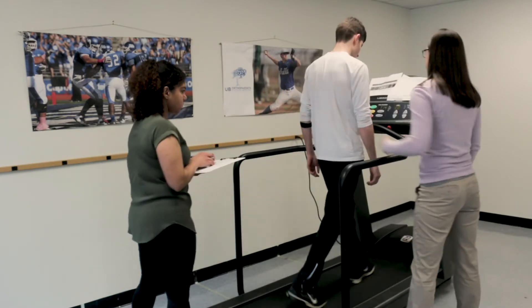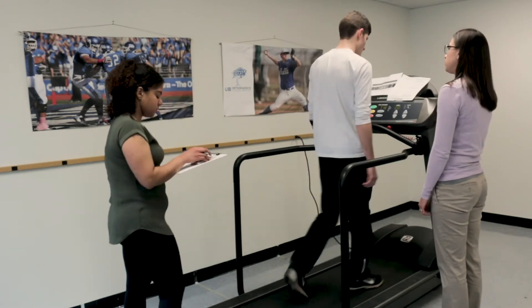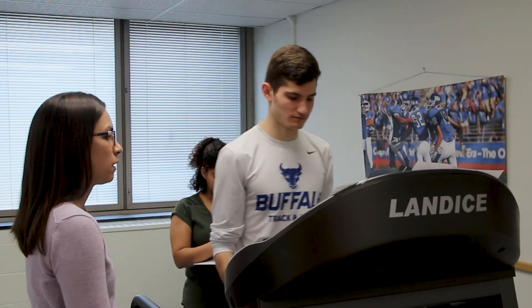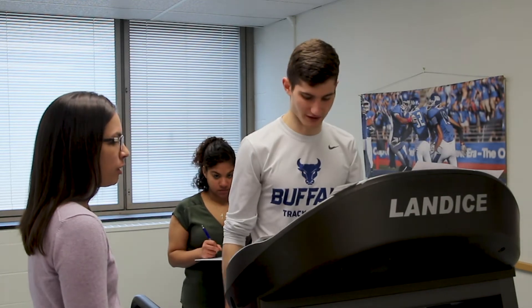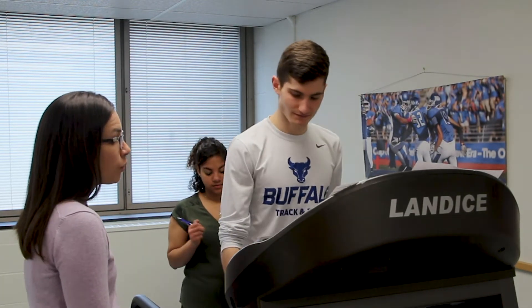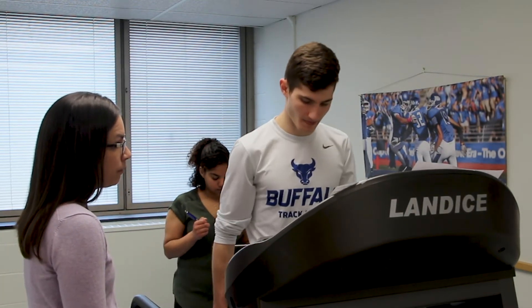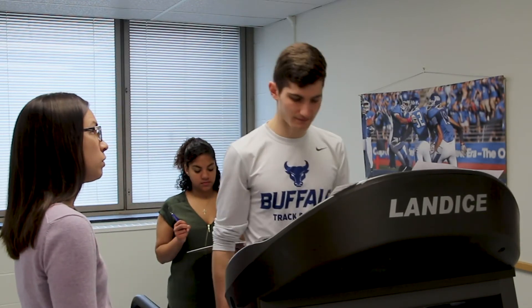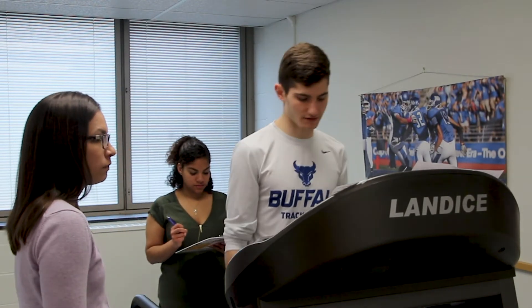How did the drop in grade feel? Did you have any changes in your symptoms? Headache worse? Dizziness? Lightheadedness? I'm just kind of getting used to it — a little change in the balance? Yeah. Okay. So we're going to walk for two minutes at this pace, and then we'll be done with the test and we'll sit down and see how you're feeling.